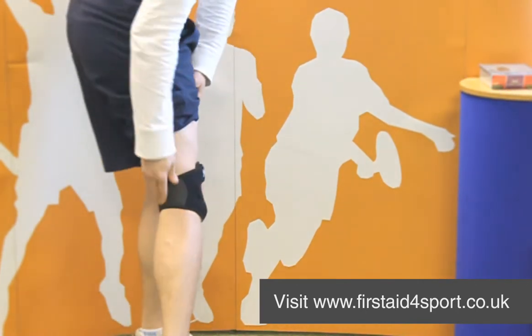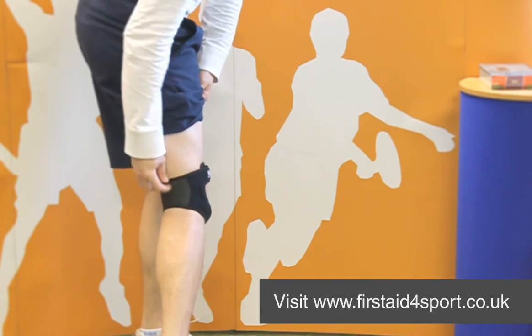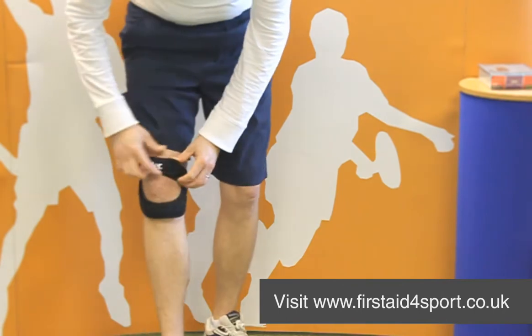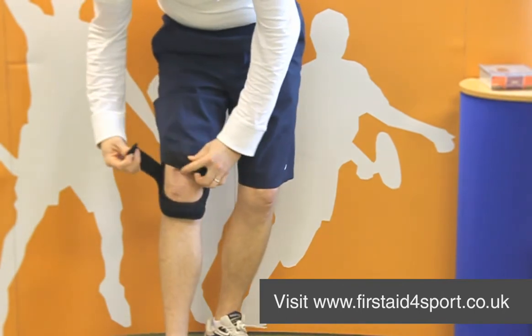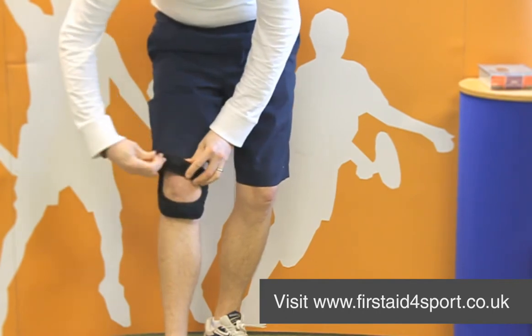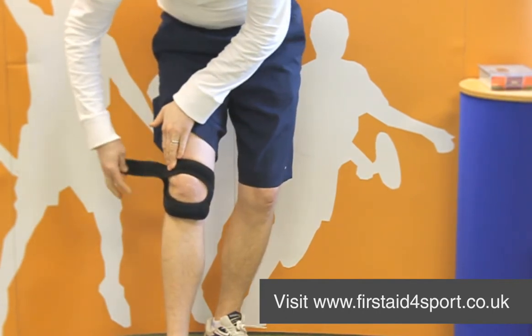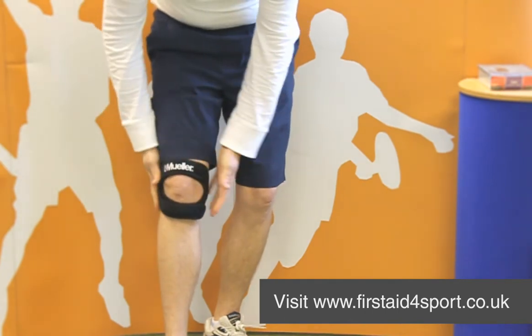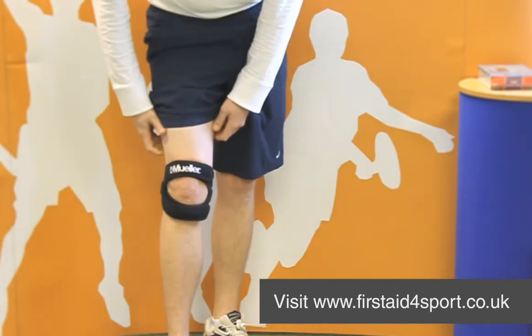It's got a very thin piece of material on the back so it stops bunching and it just sits on the knee. This can be very adjustable so one size does fit most, and it is very lightweight, and because it's a Muller brace again, it's machine washable.